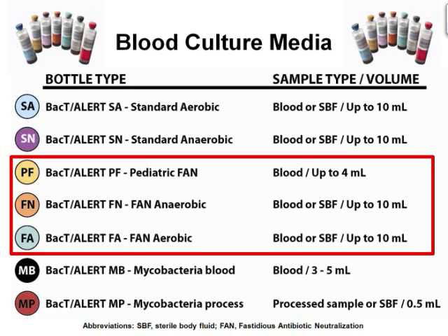The red box indicates media supplemented with brain-heart infusion and activated charcoal intended to counteract the inhibiting effects of antibiotics on blood culture yield. These bottles have demonstrated increased recovery of gram-positive and gram-negative bacteria when in the presence of antibiotics.